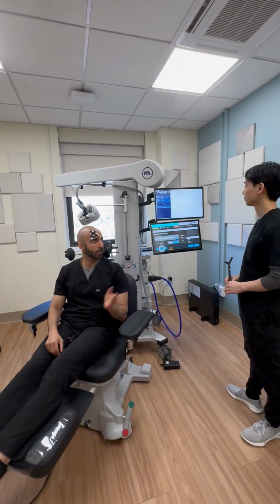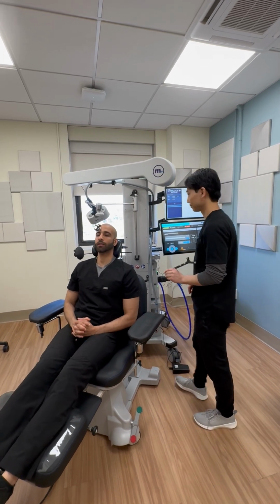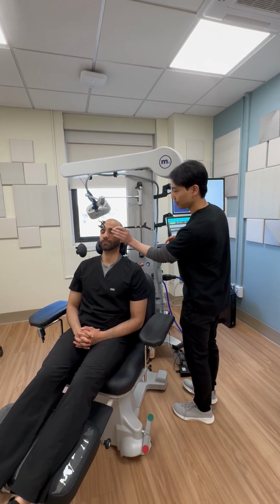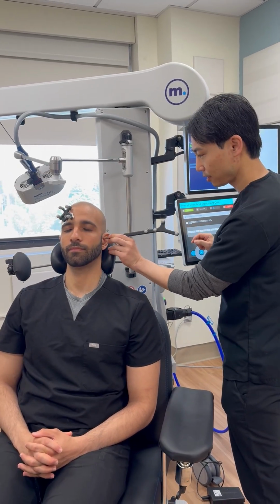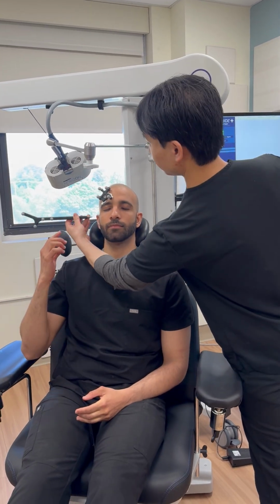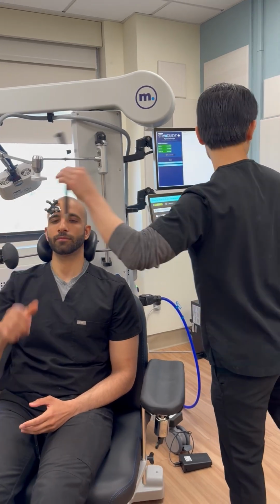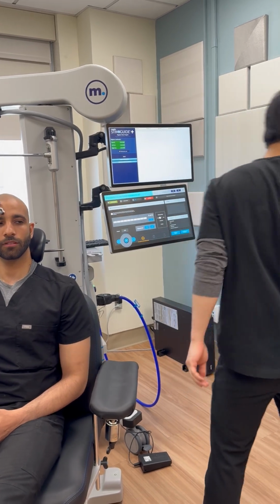And we'll start off with doing the landmarks with the nasion. Take it away, Dr. Cotto. So this is going to give a basis of the orientation of the patient's head. So we're going to start with the nasion. Then the left ear. And the right ear. Right there. And make sure these are facing the camera, otherwise it's not going to know where it is. Perfect.